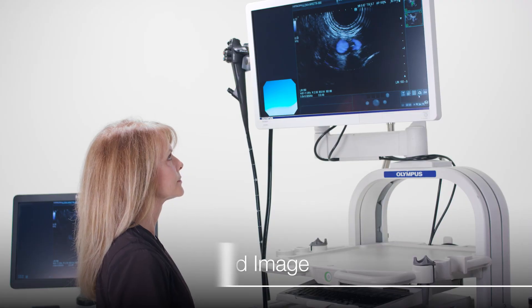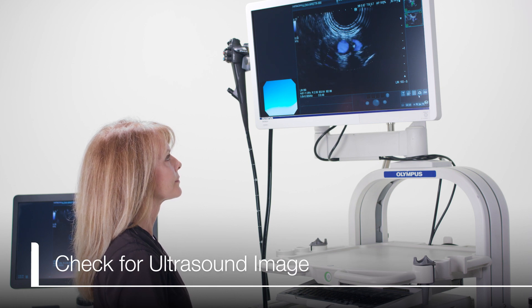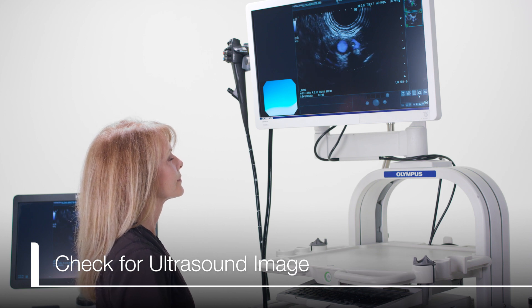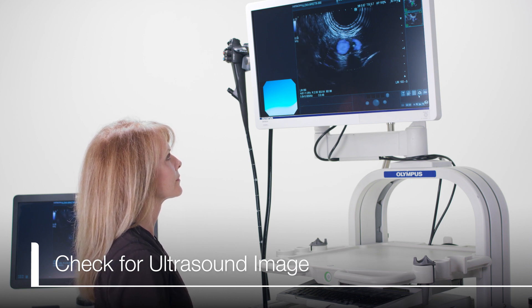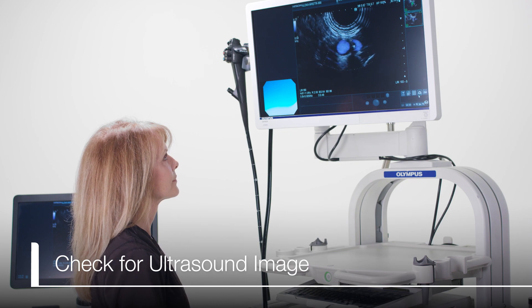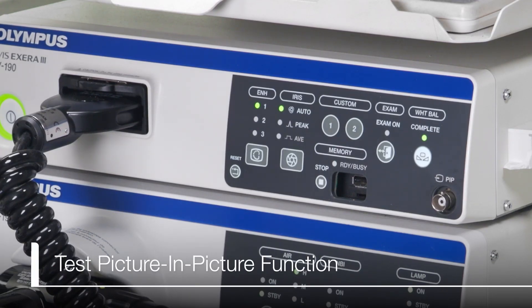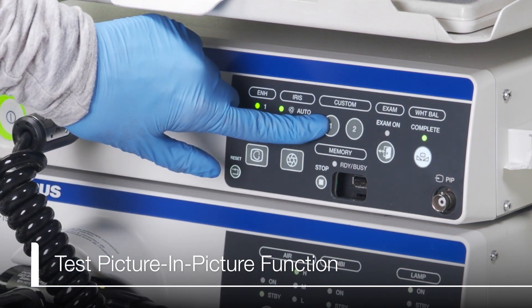After attaching the cable of choice for picture-in-picture, check that the ultrasound image appears on the room monitor. To do this, first ensure both the Arrieta 850 and CV190 are on and a scope is plugged in. Test that the picture-in-picture function is working by pressing Custom 1 on the front of the CV190. A sub-screen should appear on the monitor.